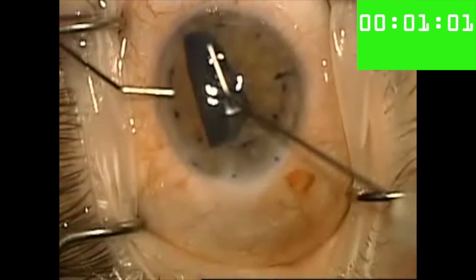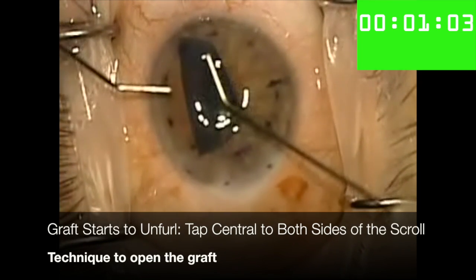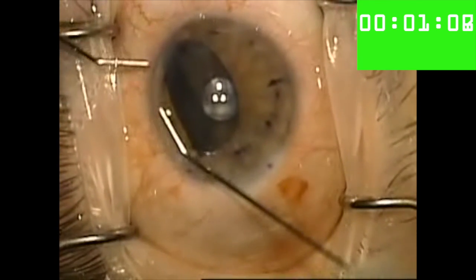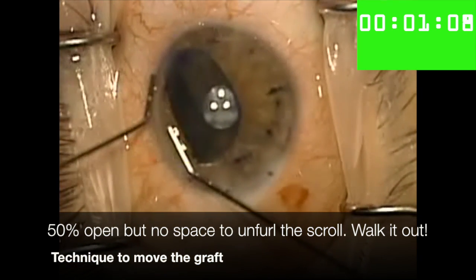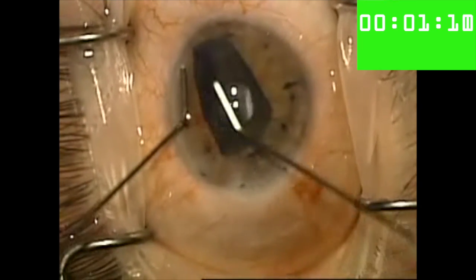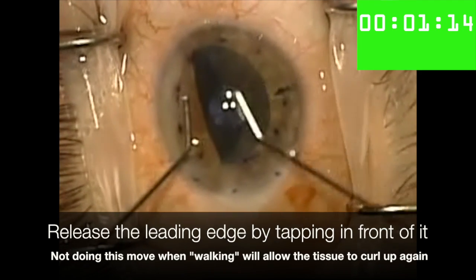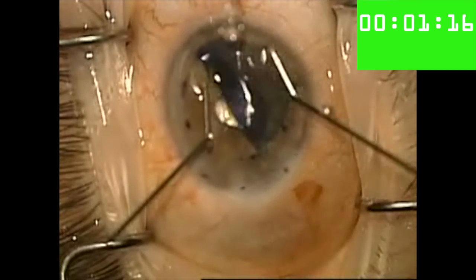As I continue to tap in the center of the scroll, the right side of the scroll continues to open up, but the left side of the scroll cannot open up because there's nowhere to go in the anterior chamber. The solution here is to walk the entire graft across the chamber by shuffling the cannulas, and intermittently tapping the most distal leading edge of the scroll to keep it from rolling up again.